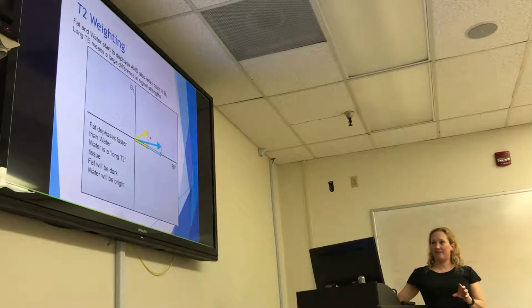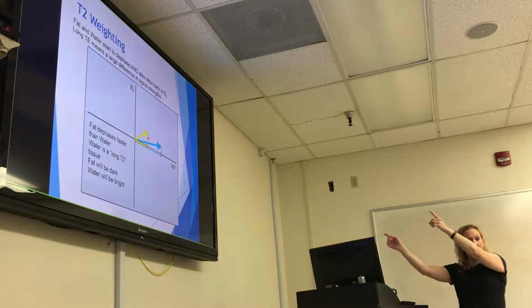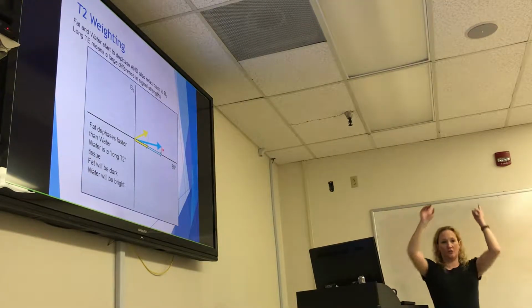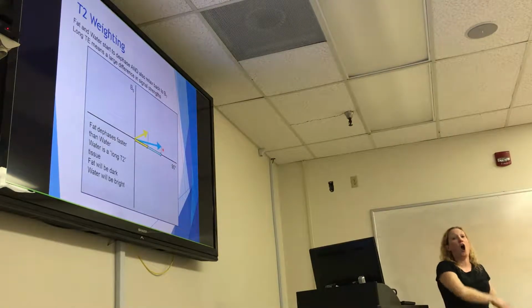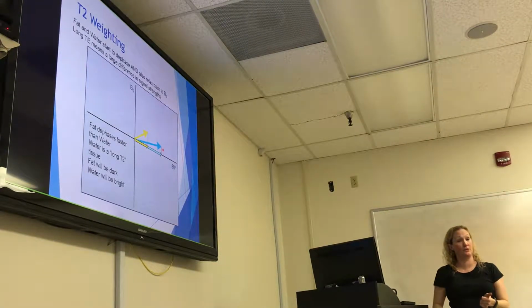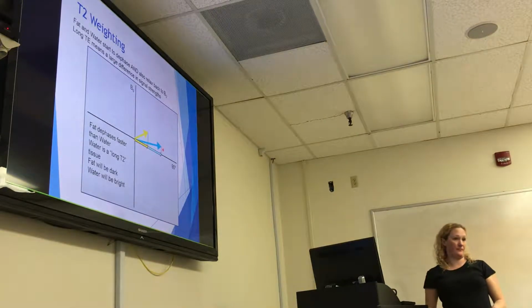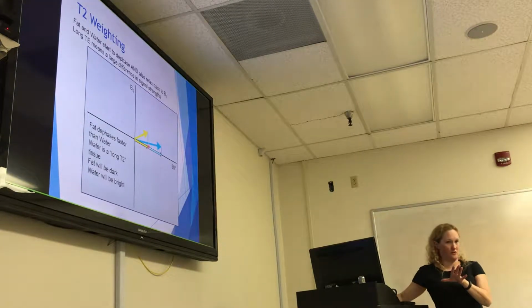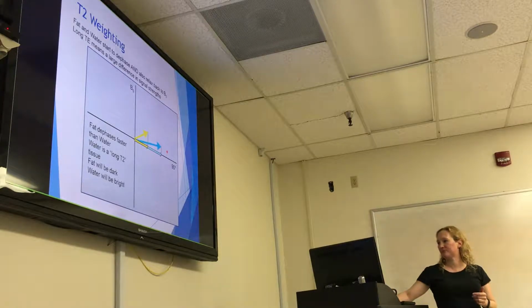So yes, I've made them different as far as a little bit of T1, but really the biggest difference is that the fat has dephased, so it's shorter, which means it has less of a transverse component, which means it has a lower signal, right? Whereas here our water, still spinning together, gives strong signal on a T2 because they're still in phase, all right? And so again, you can see that in the amount of that transverse component of these vectors that's remaining.